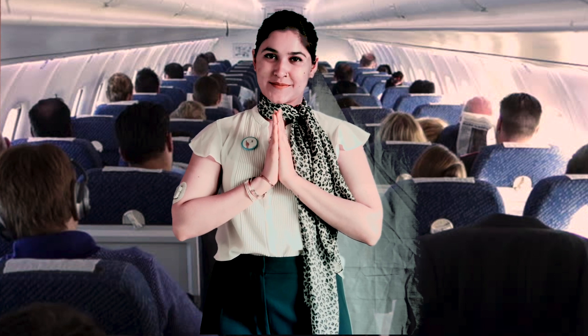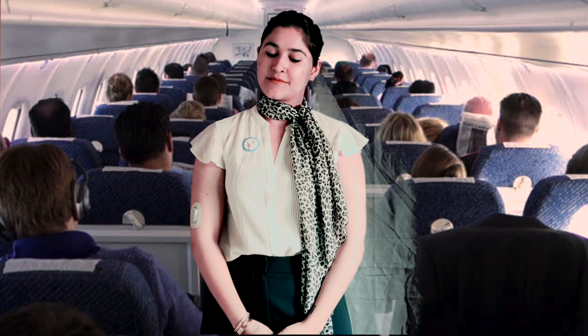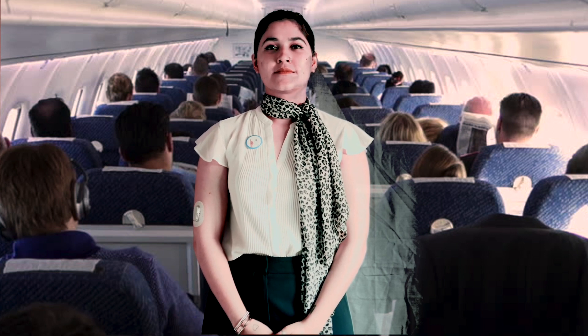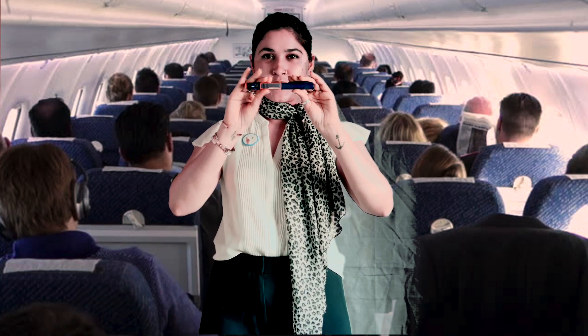Good afternoon, ladies and gentlemen, boys and girls. Welcome on board Type 1 Diabetes Airways, flight T1D, in operation to everywhere. Before we begin our journey, please pay careful attention to the safety briefings of this life to administer insulin.